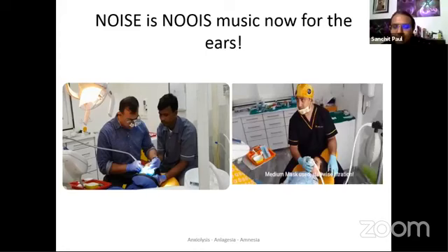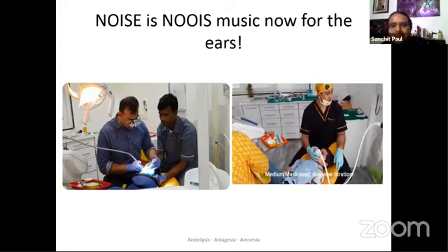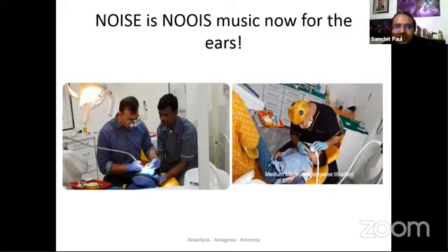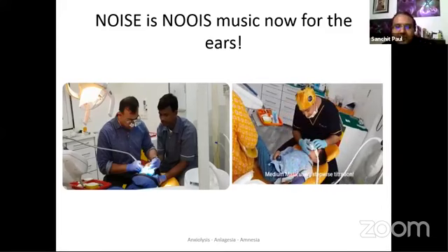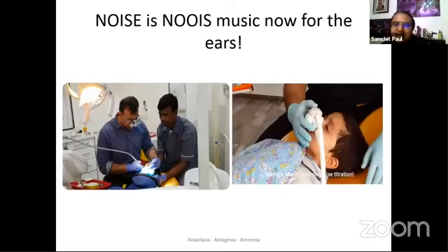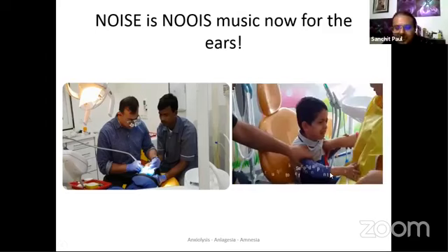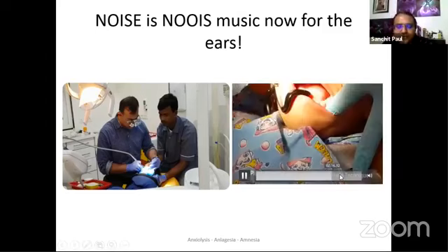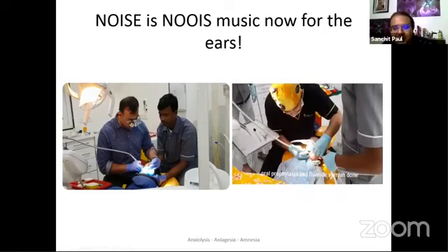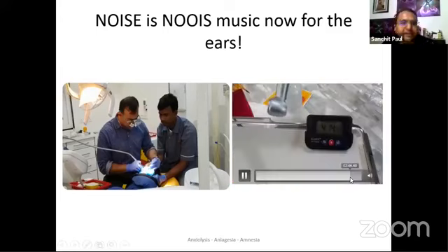So alone, nitrous oxide gas will not make things happen. We always need to involve our basic behavior management techniques in the form of tell-show-do, in the form of voice modulation, in the form of modeling, desensitization, and most important, the TLC, the tender love and care. Together, all of them lead to a good outcome where we are able to do the desired treatment in a more pleasant way, and the child and the parent both go with a feeling of, wow, this was fantastic.